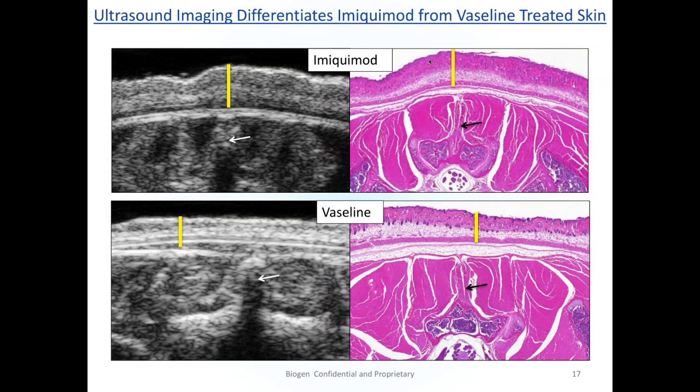Contrast had issues. We were getting really nice contrast data from kidney and liver, as I said before, with contrast microbubbles. We weren't able to put a whole lot of time into it, but what we were finding is that there were enough bright signals already in adjacent skin areas.